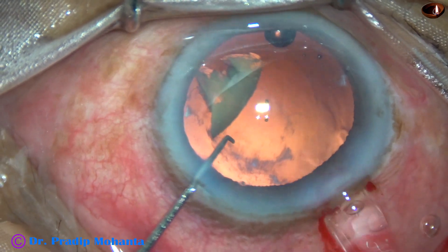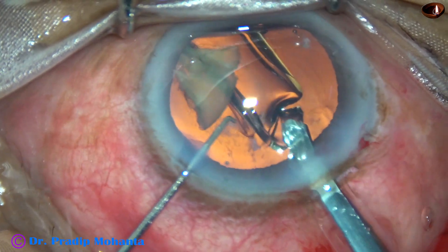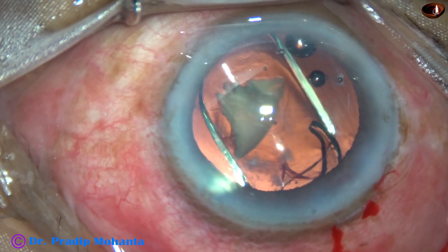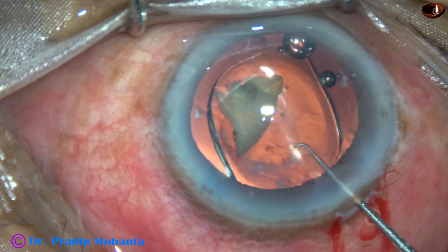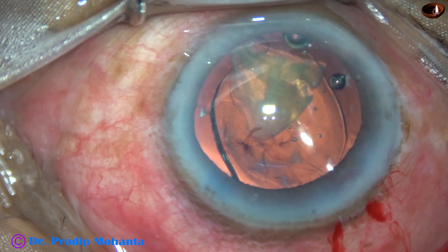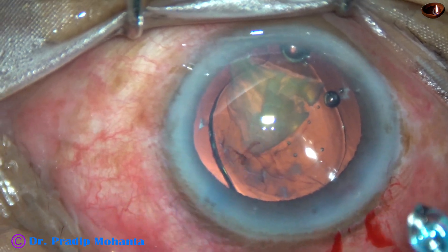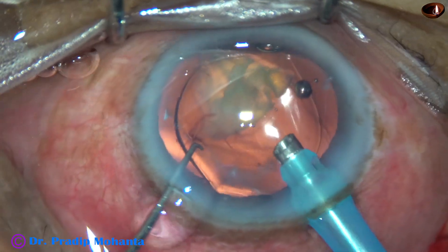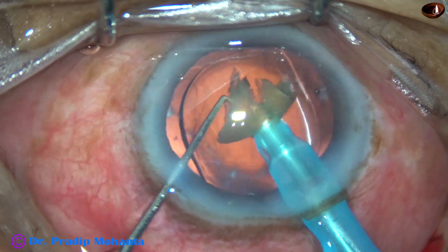And now I inject some more visco and then implant an intraocular lens. This is a hydrophobic acrylic single-piece monofocal intraocular lens. Once the leading haptic has gone into the capsular bag, the trailing haptic has also gone into the capsular bag. And now it is absolutely safe — 100% safe — to emulsify this last piece. The IOL will act as a beautiful platform over which we can emulsify this last piece.